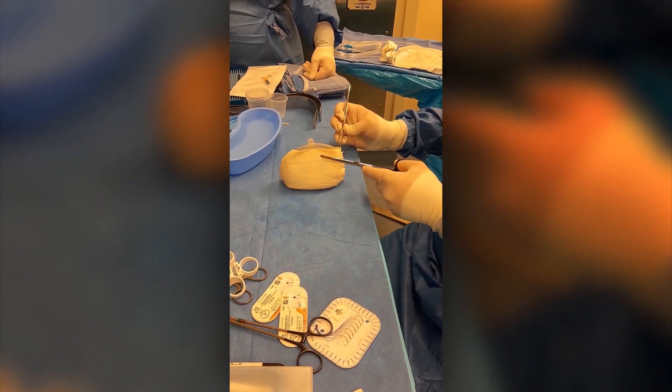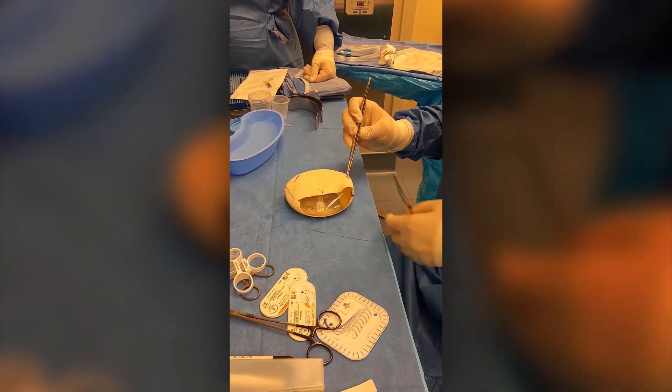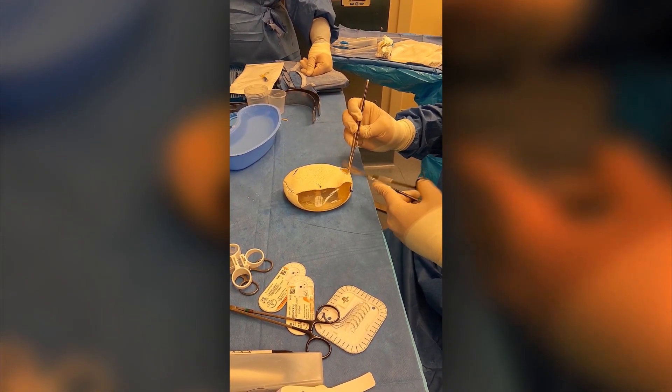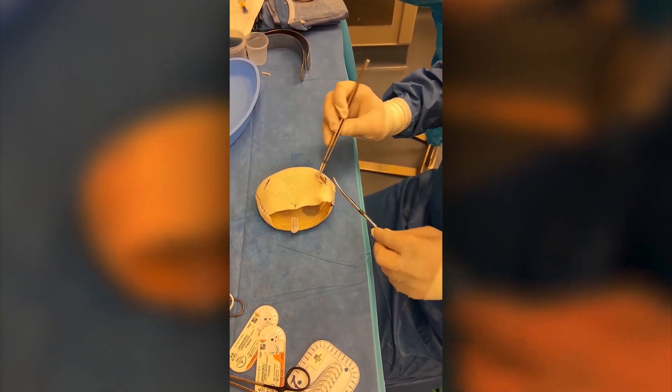So now I've positioned this once again to cover the entire anterior surface. I'm going to put a stitch here on the front in a minute and I've put a stitch in the back just to prevent it from shifting. What I'm going to do is get the tabs out here — I make a little cut in the material over it and then I just use that little cut to flip the tab out, and then I'll sew this so that it doesn't flip back in.